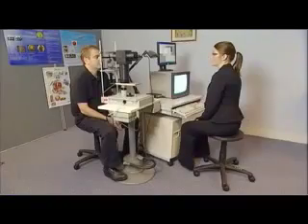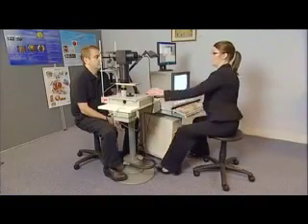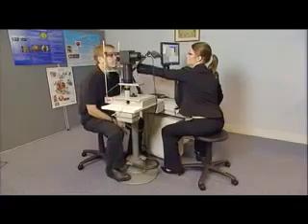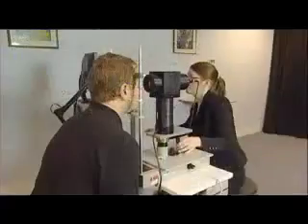To perform the test, the patient is seated comfortably at the interferometer and the head is positioned on the chin rest.